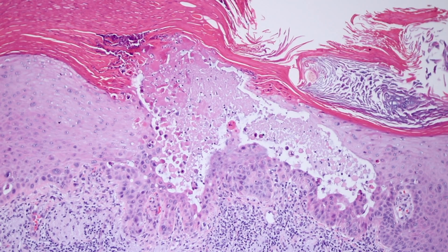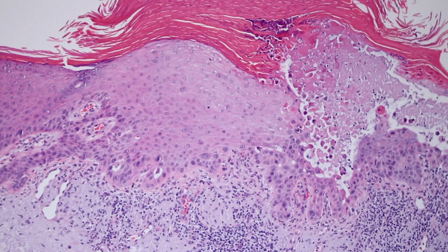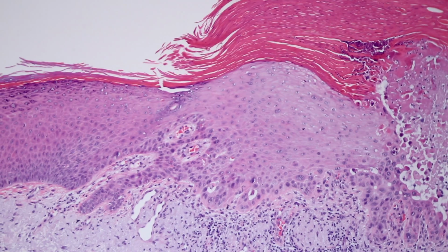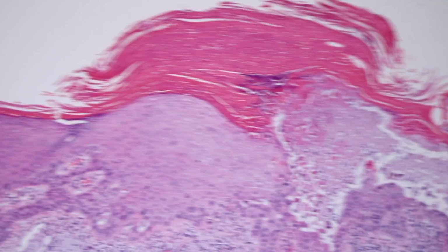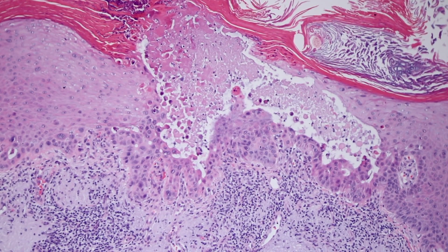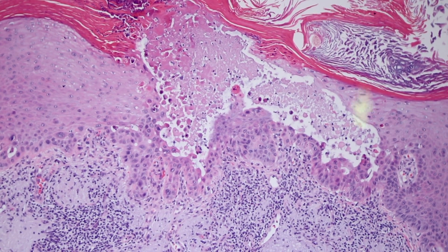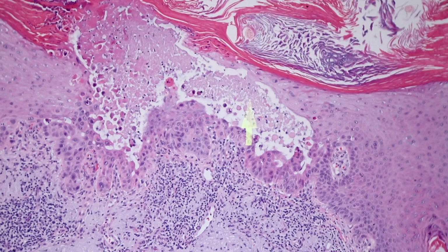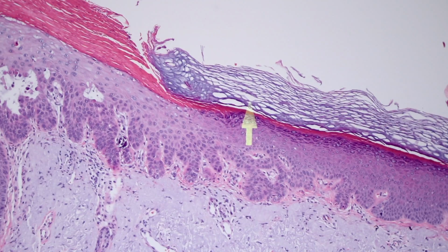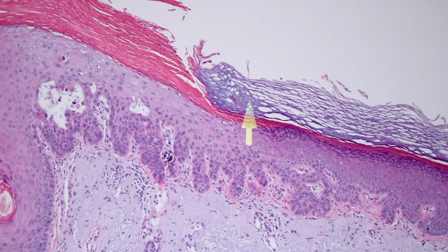And the general approach that I use, and it doesn't always work, is I try to look away from that area. Is there anywhere else that's intact where I can see full thickness atypia or pagetoid spread or something else? And if there's not, then usually I kind of back down and ignore areas like this and don't try to say, oh, that's full thickness because the epidermis stops here and there's atypia all the way there. So I try to not judge those areas as much, and I look over to the periphery and see what the rest of the lesion looks like. And here the rest of the lesion looks like actinic keratosis. That's my approach, at least.